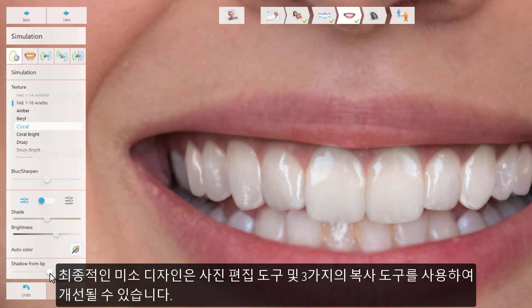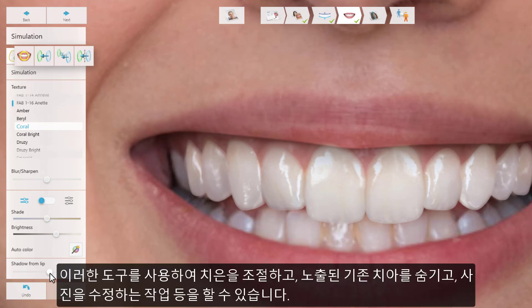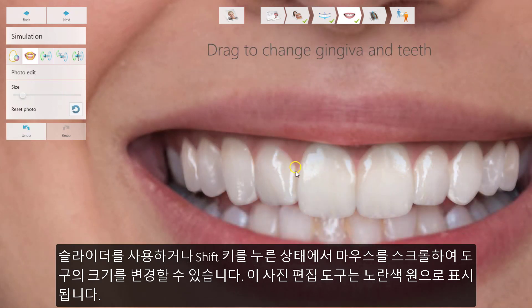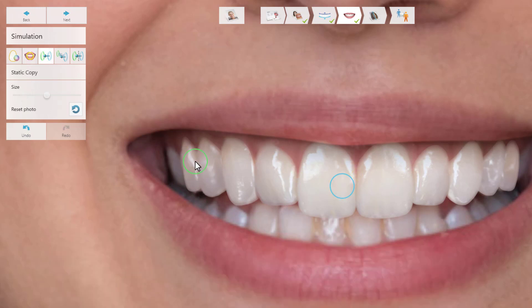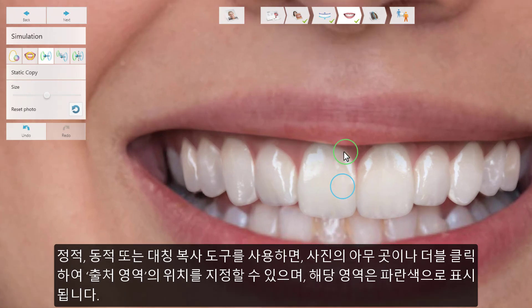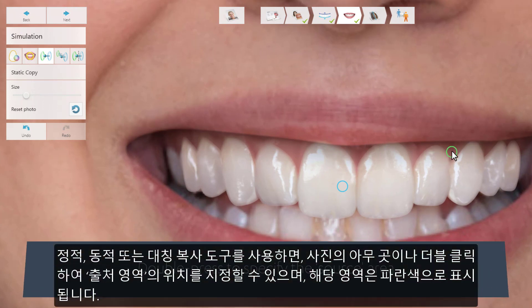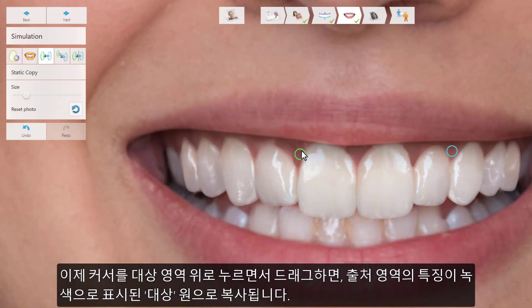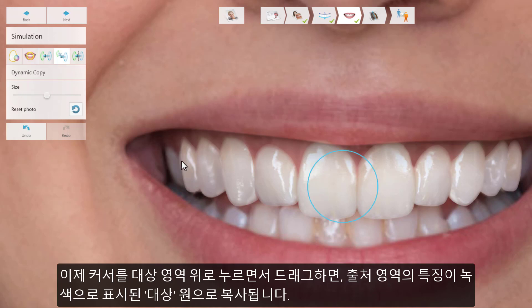The final smile design can also be improved using the photo edit tool and the three available copy tools. These tools allow for gingiva adjustments, hiding exposed original teeth, touching up the photo, and more. The size of each tool can be changed using the sliders or by holding shift and mouse scroll. The photo edit tool should be positioned so that the yellow circle surrounds a region of the photo you want to drag and stretch. The copy tools — whether static, dynamic, or symmetric — work by double pressing anywhere on the photo to specify the location of a source area, shown in blue. After you press and drag the cursor over the destination area, the pixels placed inside this blue boundary will be copied over to the destination circle, shown in green.